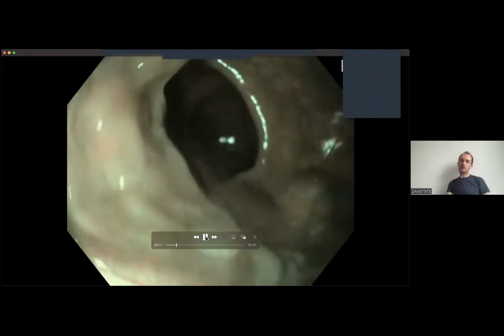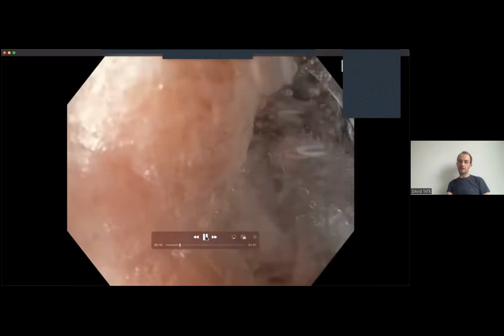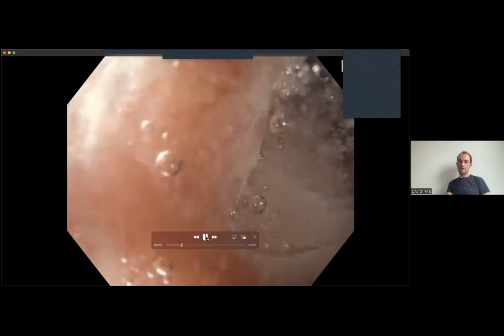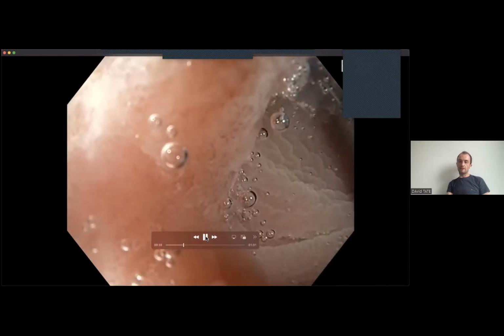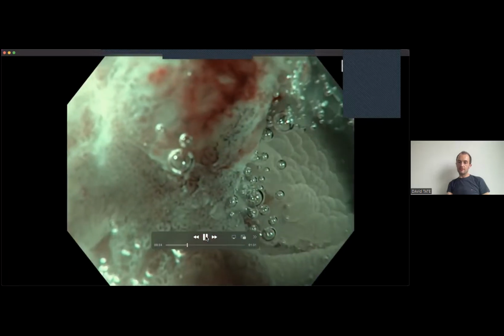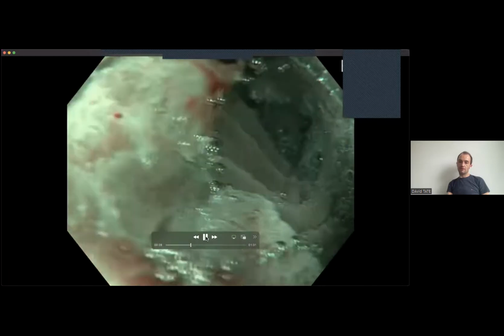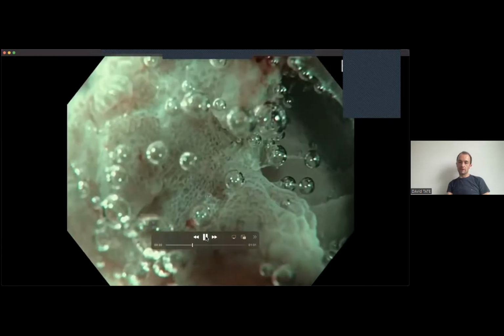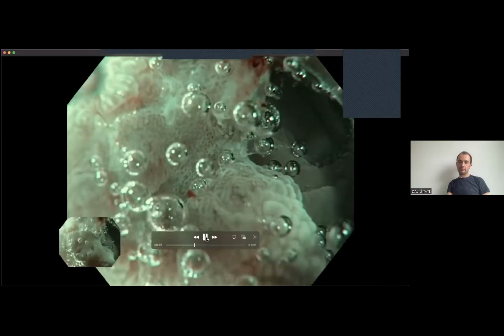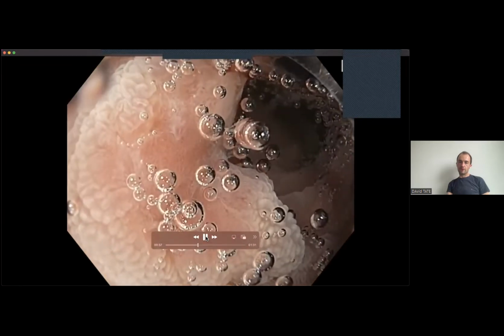First thing, people that haven't done colonoscopy may think until now they hadn't seen a polyp, and I think that's fair enough. Some of these things can be very difficult to see. Again, Sandy, we are using the underwater technique, which in this case is critical. Maybe I answered your question a little hastily. There are some cases in which it's completely necessary. So what do you think?